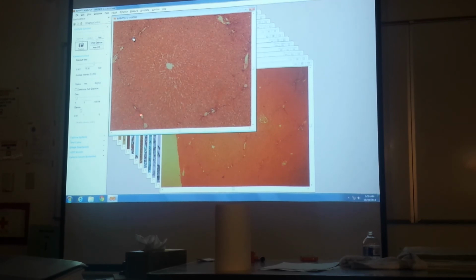Higher mag, can you see how blood would percolate through towards here? Well, there are little sinus spaces where blood is percolating through. So that's what you would identify. That's a venule. There's hardly anything there as far as a vessel wall. But I know it's a venule. That's where they're located.